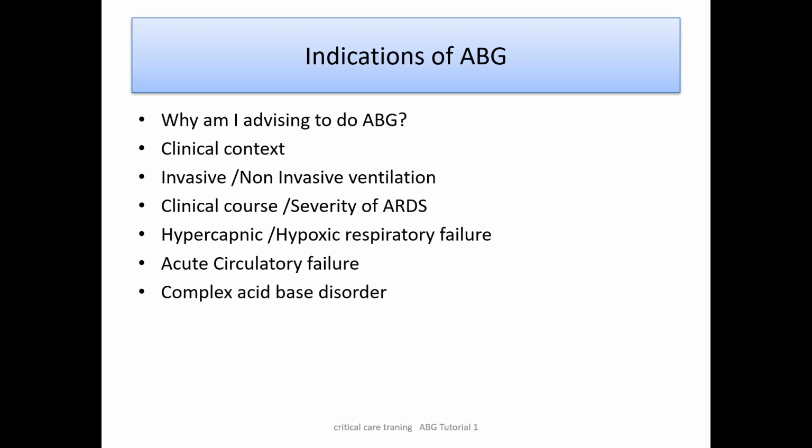So the first question, as in the ICU, before any investigation we ask: why am I advising to do an ABG? Arterial blood gas should not be just a routine order. You should have your diagnosis and clinical context in your mind, what you are trying to find out in the ABG.